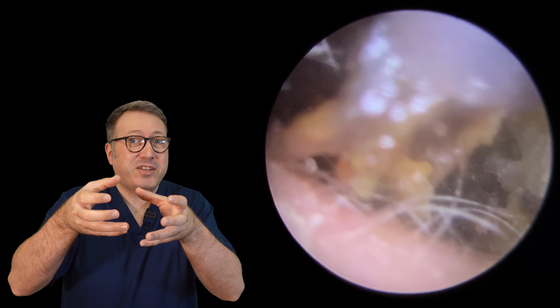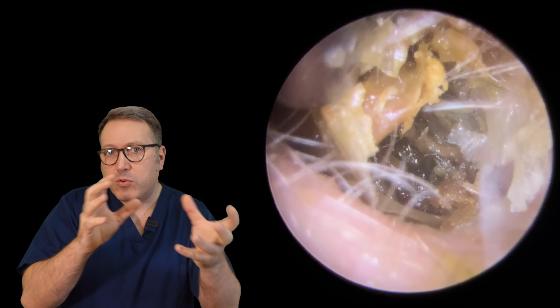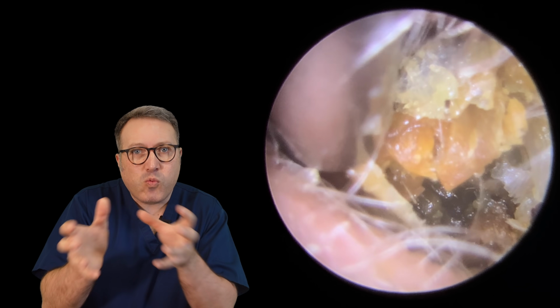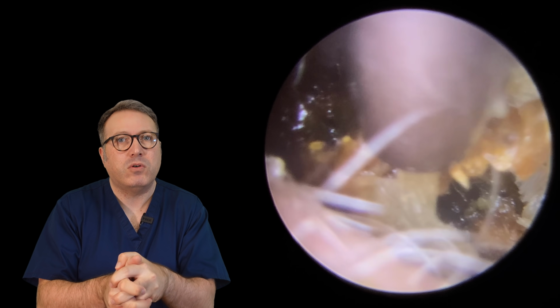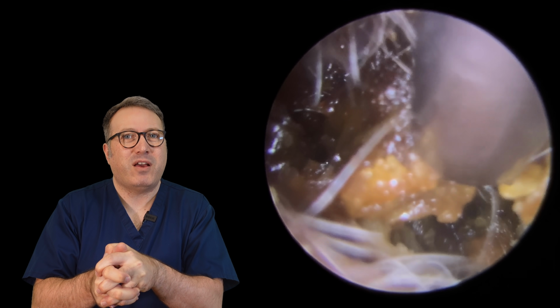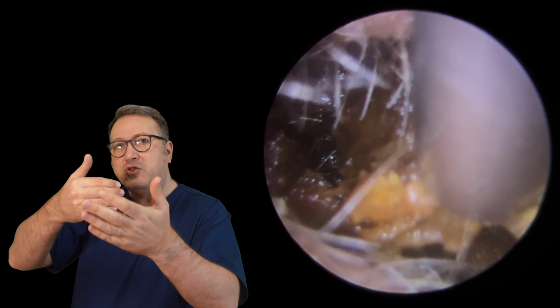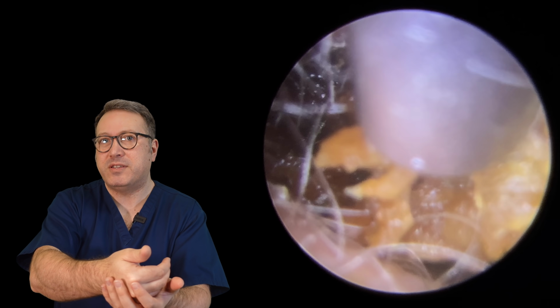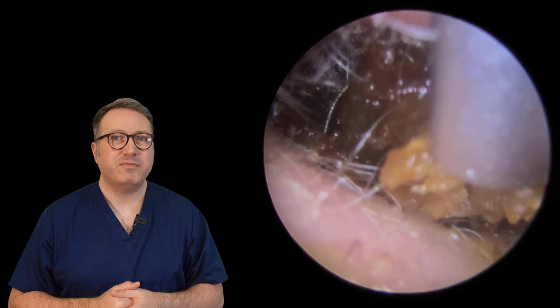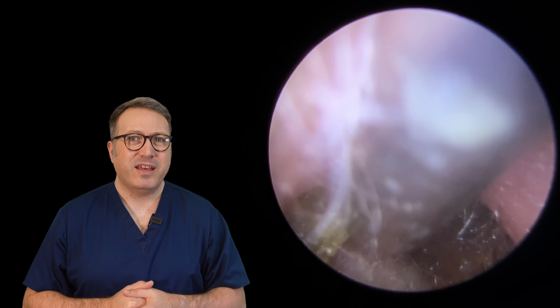There we are, you can just start to see a bit of wax come away from the top there. It's going to give us a little bit more maneuverability. We're going to be able to wiggle this back and forth just a little bit more. There we are, we can start to get a grip on that wax layer behind now. You can see how it's changed in colour. We've got the dry skin at the front, the wax behind now, this darker material starting to come down the canal. There we are, you can just see it there.